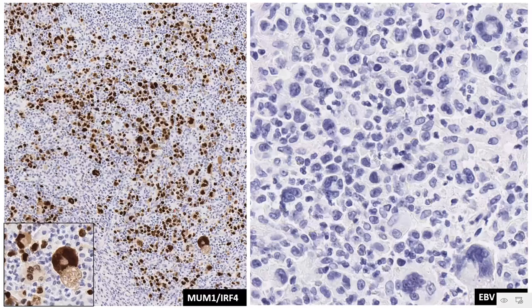So as I said, the IRF4 is a marker which is strongly expressed in these cells, just like we expect in the case of a classic Hodgkin lymphoma cell. But one strange finding in this particular case has been the negativity for EBV LMP1, because these cases are usually strongly associated with Epstein-Barr virus infection. So that's a little bit of an outlier.